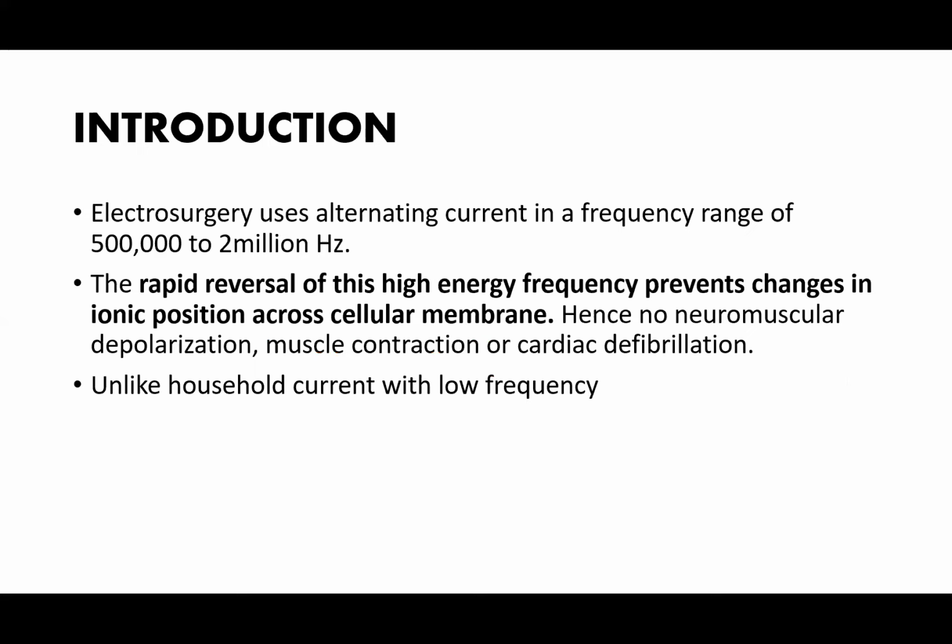to 2 million hertz. Now, with this high frequency, the rapid reversal of this high frequency prevents changes in ionic positions across cellular membrane.